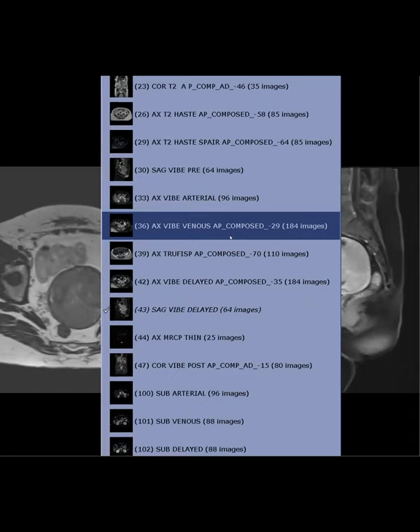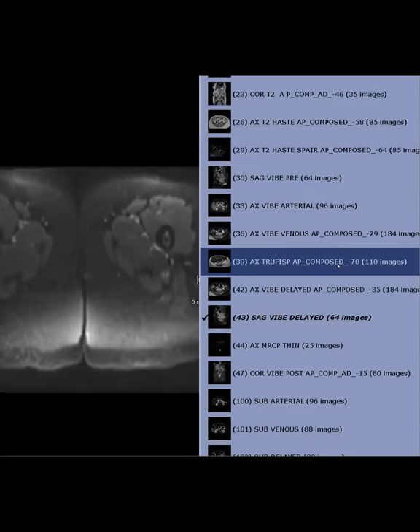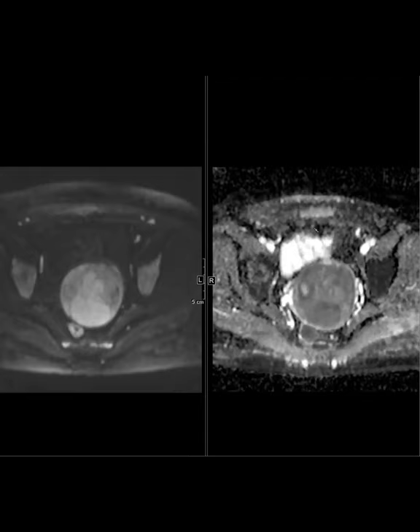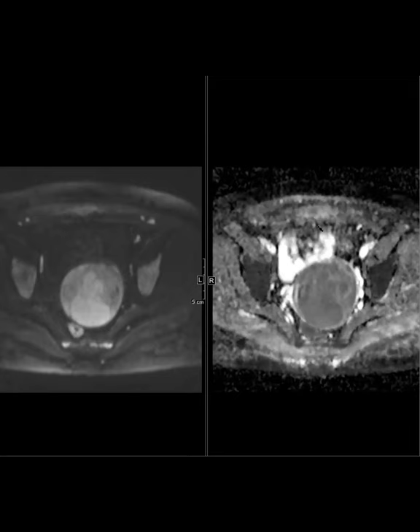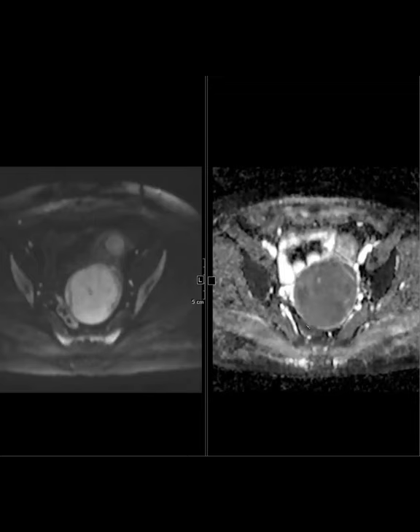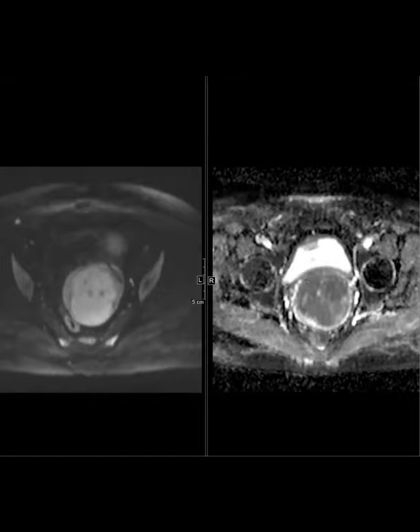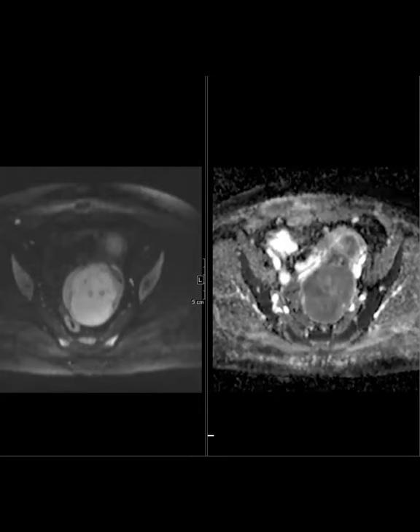I should. Let's see. So, a lot of restricted diffusion. I don't know if that helps, because fibroids can also restrict, and cervical cancer, I presume. I thought sarcoma or leiomyosarcoma will restrict more than a conventional fibroid. But this one was sarcoma, right? You said? Yeah, leiomyosarcoma. Okay. Yeah. So anyway, just so you know, it exists also in the cervix. Anywhere you have smooth muscle, you can get a leiomyosarcoma.